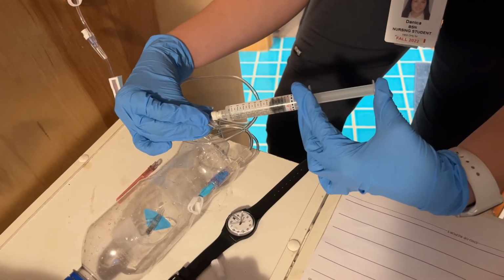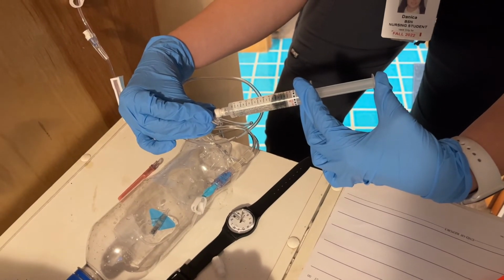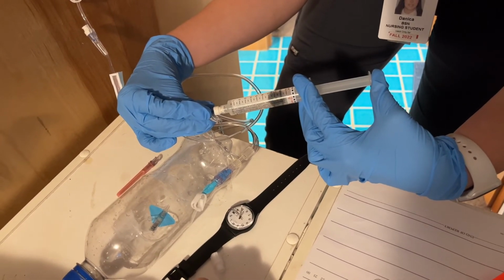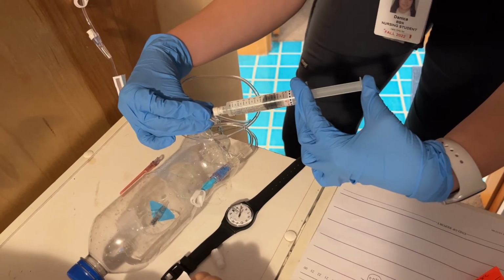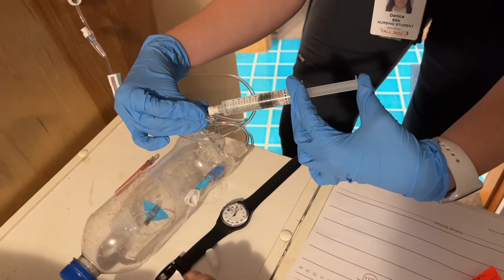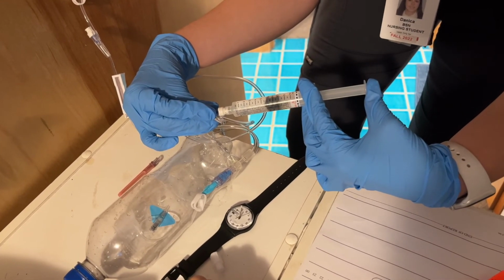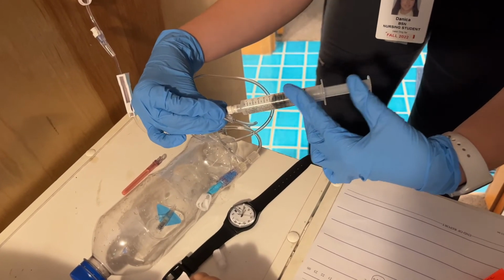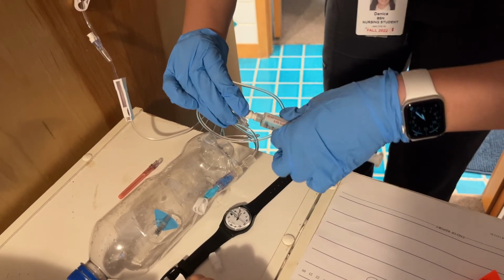And stop and wait. Then I do the other ml. And stop and wait. And the last ml. And that is the last ml in 1 minute, 4 mLs in 1 minute of the flush.